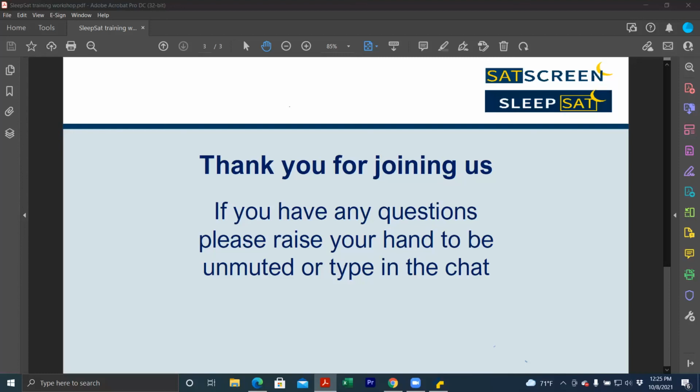And you recommend that they watch that patient video with the patient in office and then have the patient demonstrate that back to them to confirm understanding. And once the patient brings that back into the office, they can download that through that Connection Center app and either view the report directly there, or they can also look at it on that Sat Cloud portal. Is that correct? Yep. Perfect.